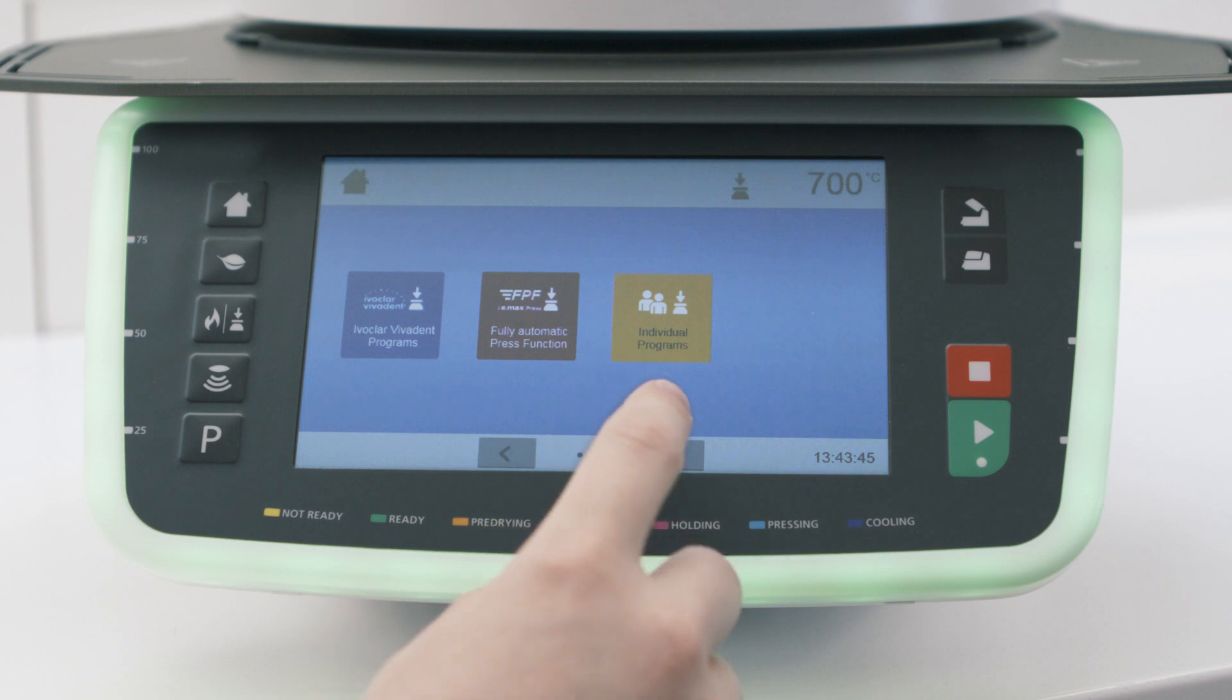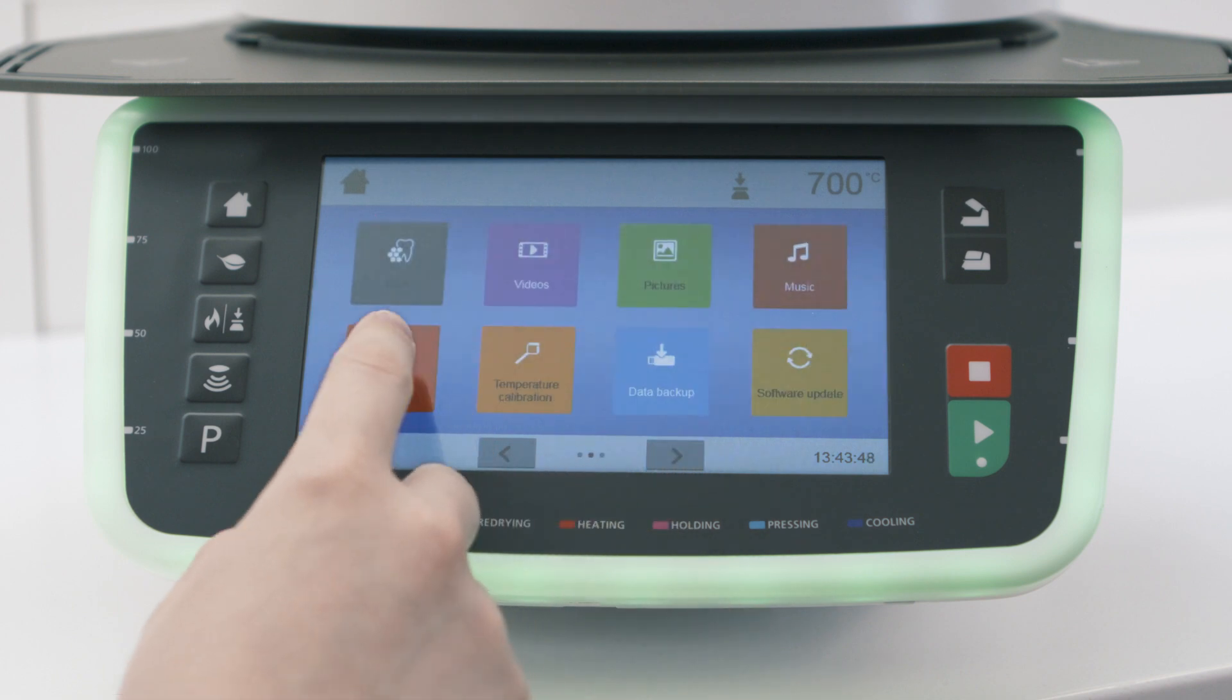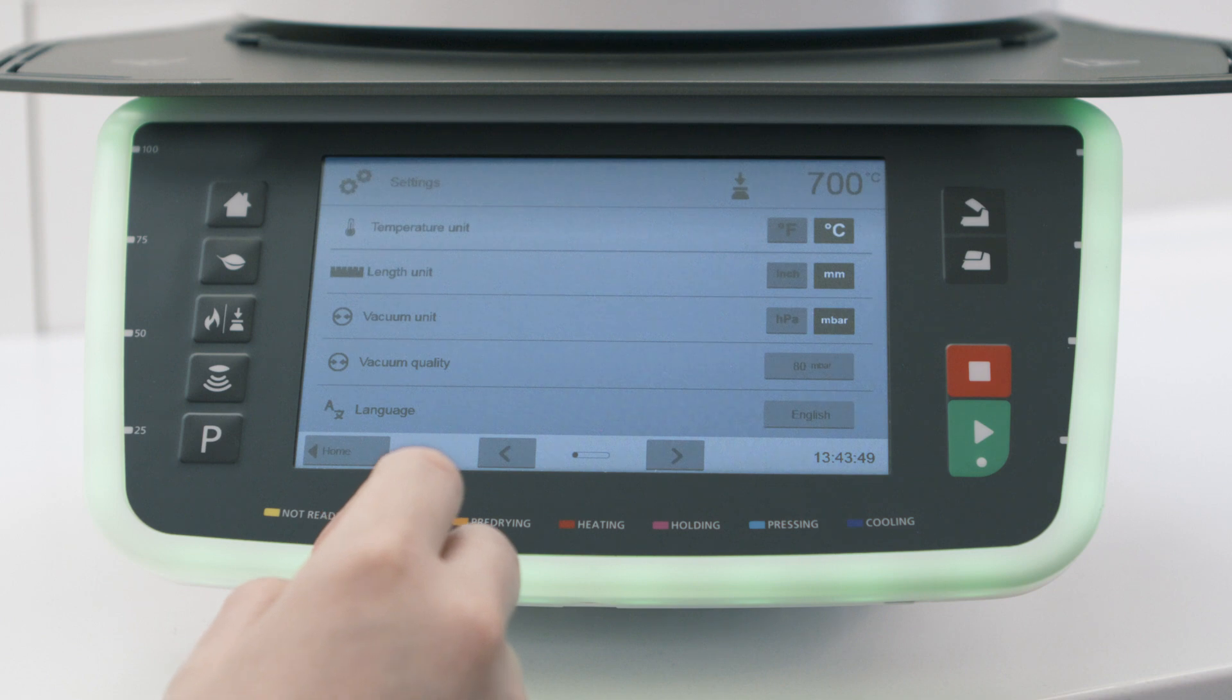The IRT investment ring recognition can be activated or deactivated in the settings menu. Make sure that the IRT investment ring recognition is activated.